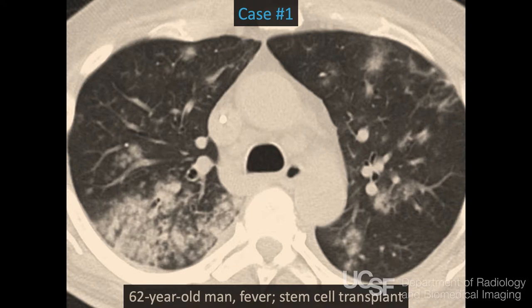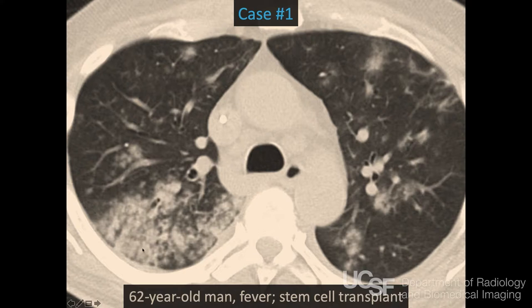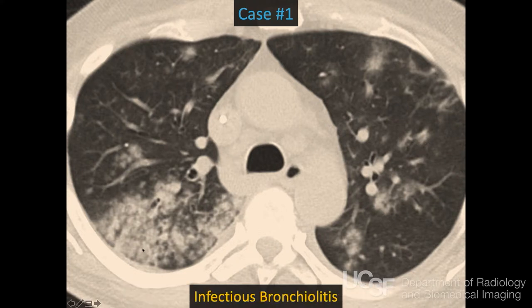We see several different findings that overlap some of the talks given this morning. We see almost more coalescent consolidation, but when you have things that are asymmetric and patchy like this, I encourage you to look in the areas that are less affected to really tease out where this process started. Over here we see a small cluster of nodules, a little bit of sparing of the pleural surface. These look like small nodules that have coalesced into larger areas of ground glass and consolidation elsewhere. This is a very good look for an infectious bronchiolitis — it's asymmetric, with nodules coalescing into larger areas of consolidation.